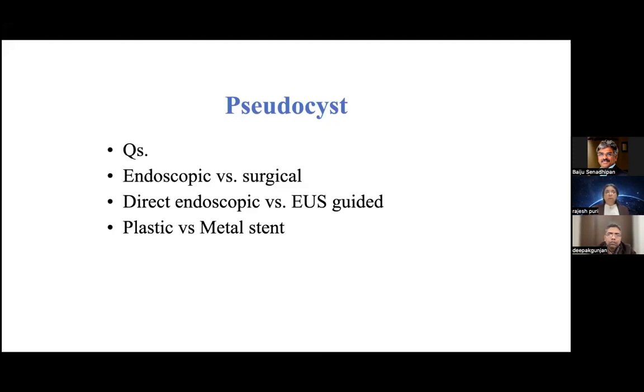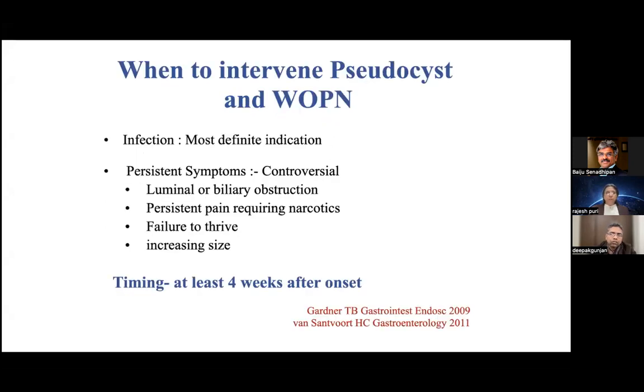And I think there is no debate. I think endoscopic treatment is the treatment of choice. You don't require surgery. And in endoscopy, EUS is better. And in my opinion, a plastic stent is more than sufficient for the treatment of a pseudocyst.